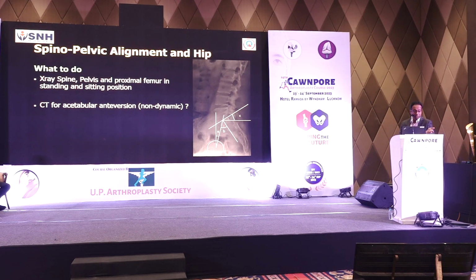You get a simple X-ray of spine, pelvis and proximal femur standing. So one X-ray in which everything is there. And people who want to look into it in more detail can also have a CT for acetabular anteversion, but you need a great radiologist to give all these angles to you.